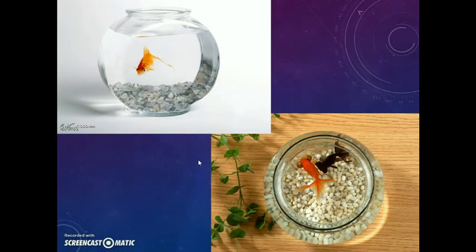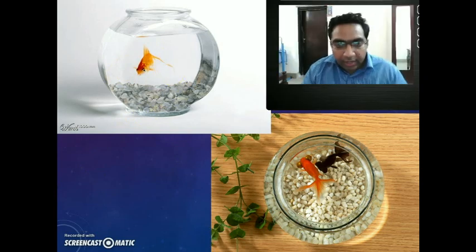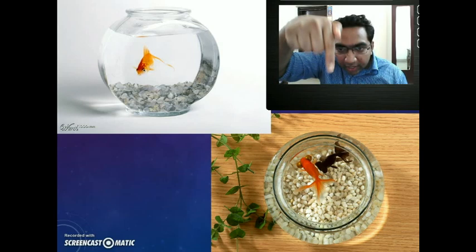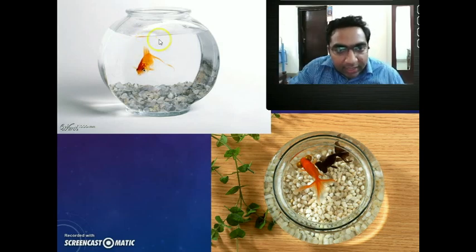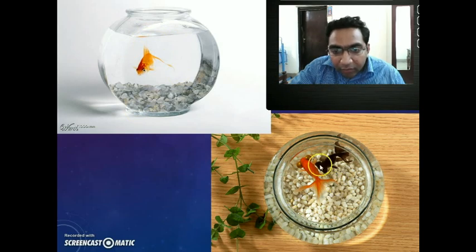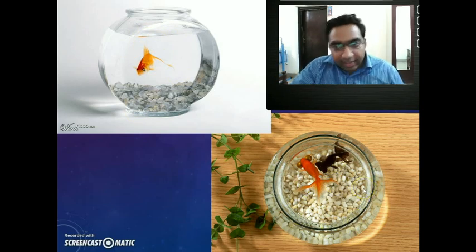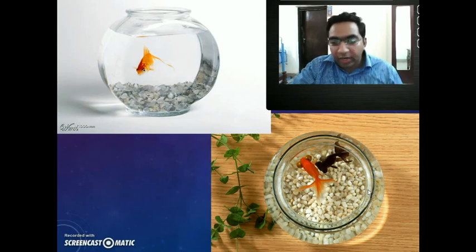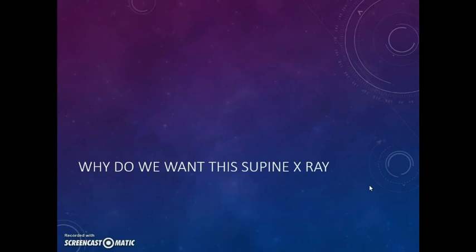Why is it like that? Here is the erect view — you are seeing the fish in the bowl. In the erect view you can see the air fluid levels, but in the supine view we will not see any air fluid levels. This is the same thing that happens in an abdominal X-ray. In erect view there are air fluid levels; in supine view there are none. Then why do we want the supine X-ray? What is its use?